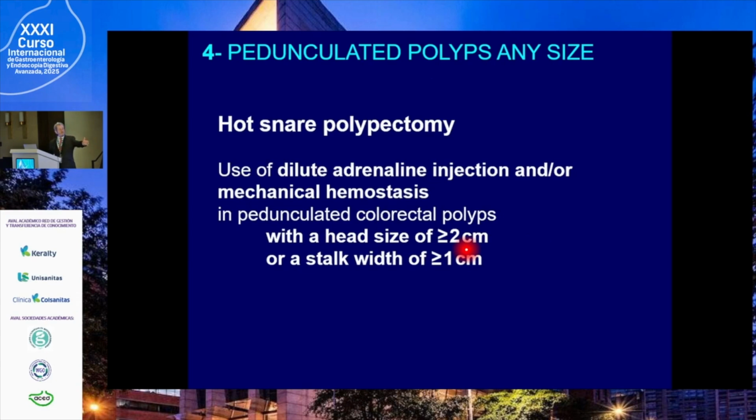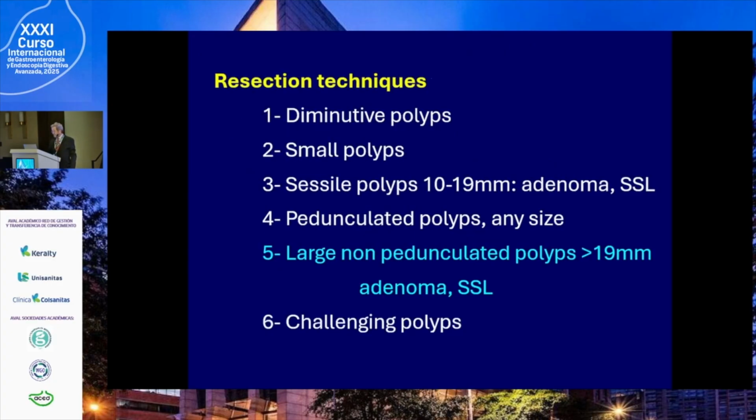You agree, Raoul? No. No, okay, you should agree always. No? In English. ESD in pedunculated polyps, I don't agree. Okay, no, okay. So I recommend, of course, hot polypectomy in this case, but ESD for large ones. Okay, we disagree. Okay, we disagree.